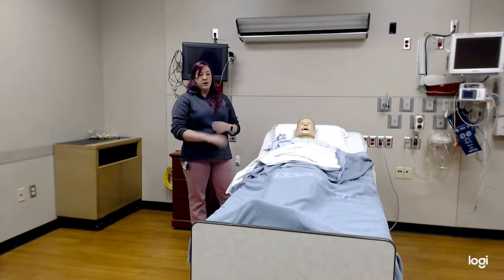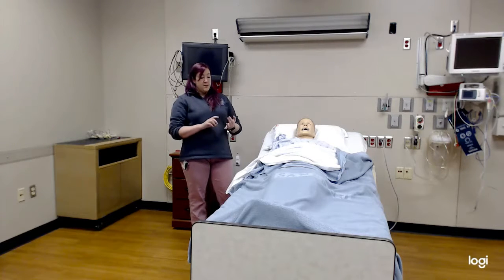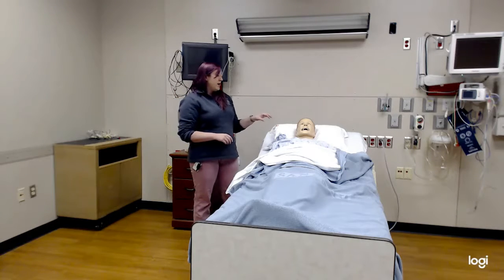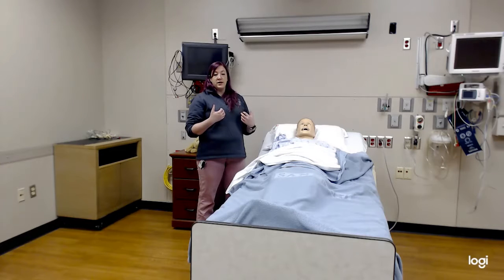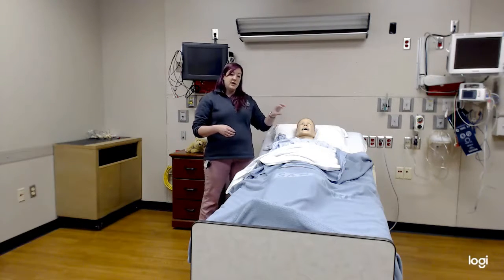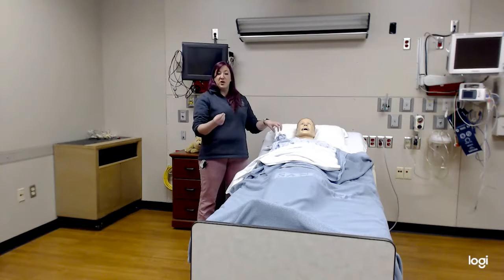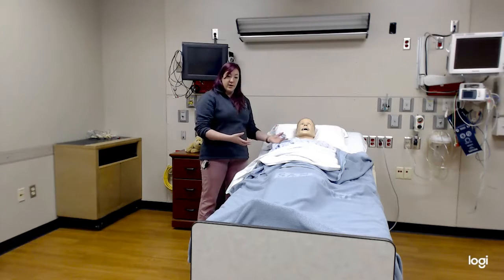High flow O2 is always the way to go. With any life threats, any problems with A, B, or C, they get high flow O2. If they can maintain their airway by themselves relatively, and they're taking adequate ventilations, you can go ahead and just put on a non-rebreather mask at 10 to 15 liters per minute. Pick one of those numbers. You can't put them on a range. Generally, our rule is go big or go home, but make sure that you're doing what's right for your patient.